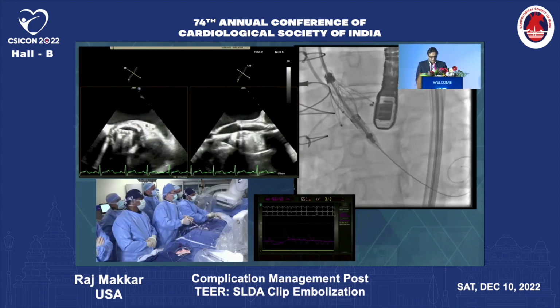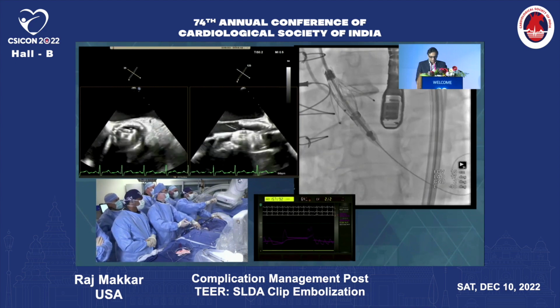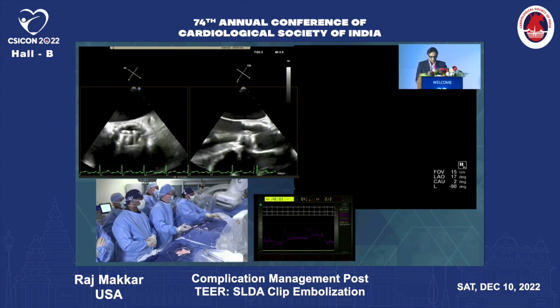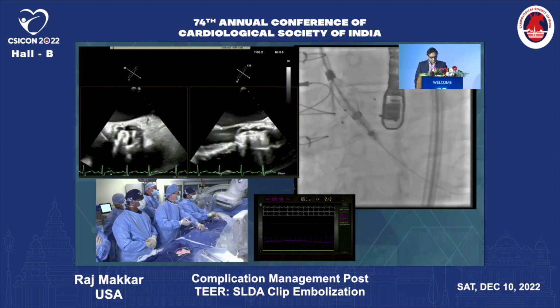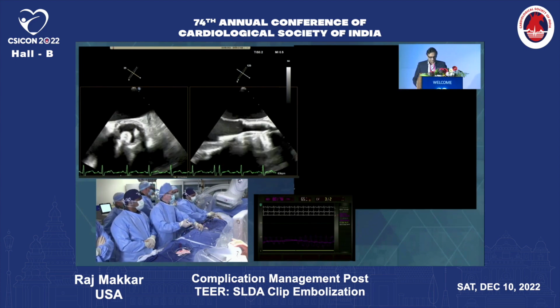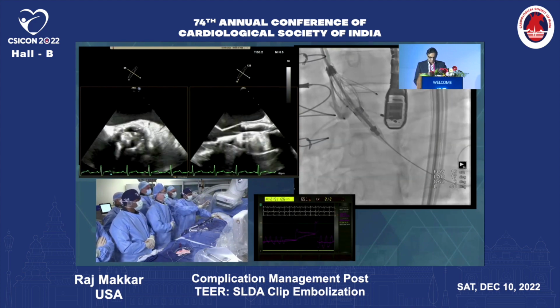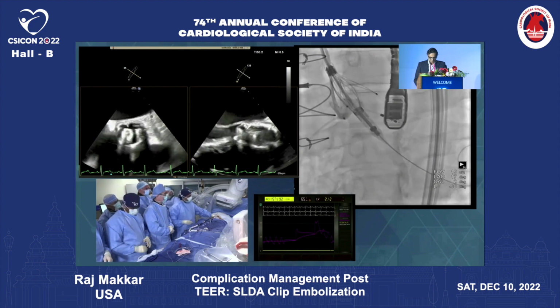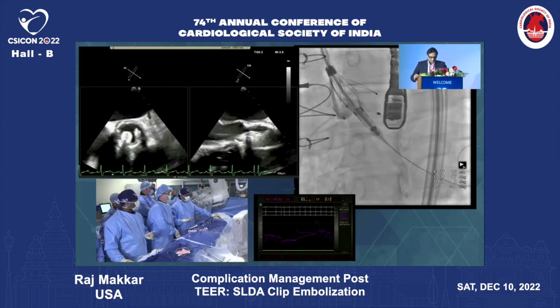So that's clearly the left. There is no doubt about it, and you can see the depth of this, right? Now, let's go here. All right, so you can see this. Non, perfect, right? So the left and the non are excellent. Now let's go to the, okay, so I feel we are good here.